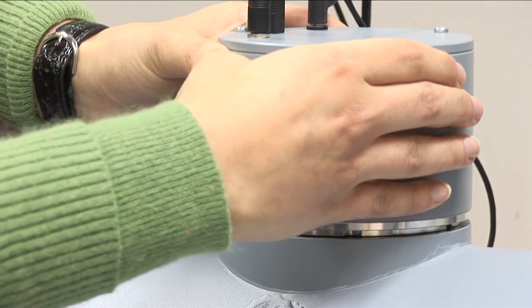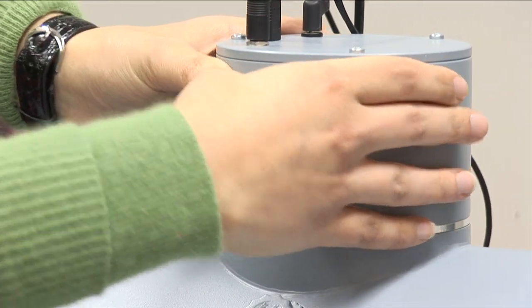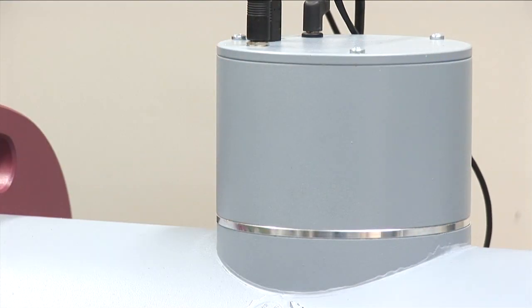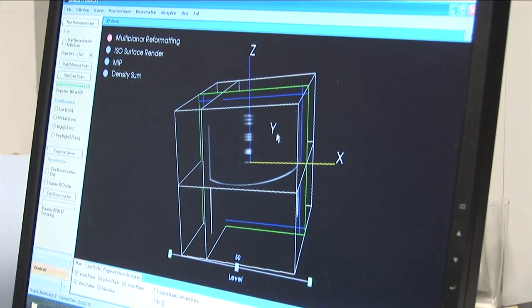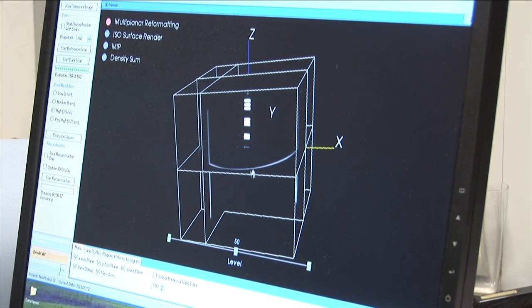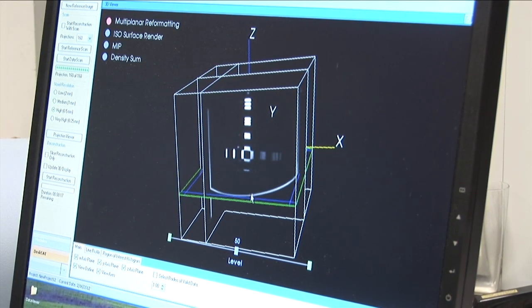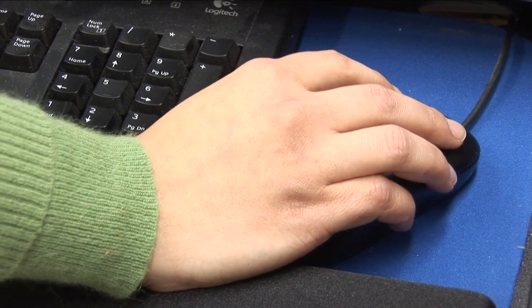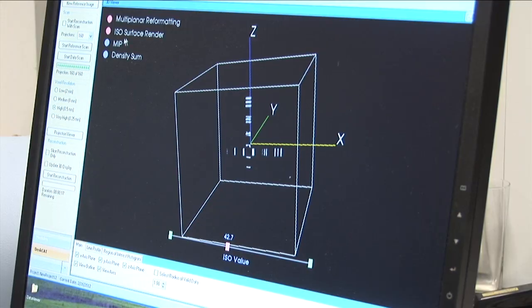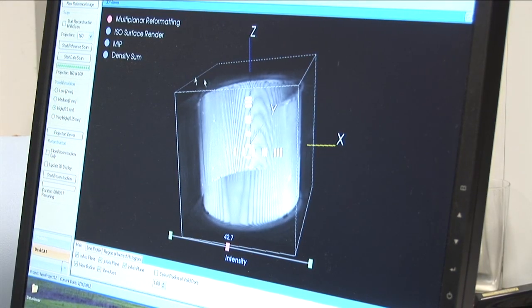This is the data scan for our phantom. This product was released less than six months ago through a small company in London, Ontario that manufactures and distributes it. Its initial release came with three plug-and-play labs, and we hope to have a dozen by the time we're done.